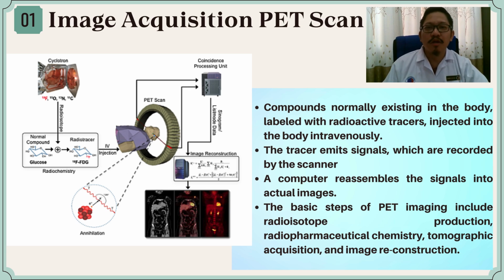Bismillahirrahmanirrahim. Assalamualaikum warahmatullahi taala wabarakatuh. My name is Muhammad Anas Fikri bin Abdul Rashid. Now I would like to talk about image acquisition in PET scan.